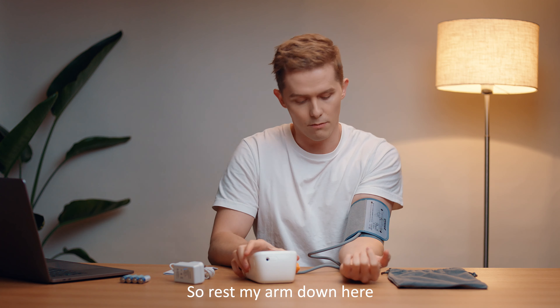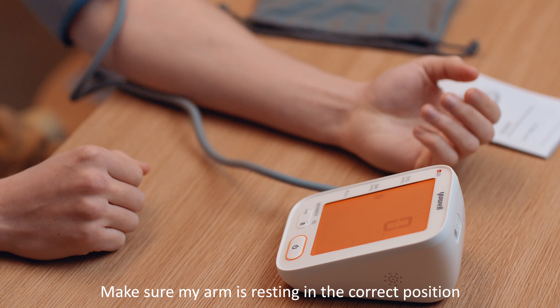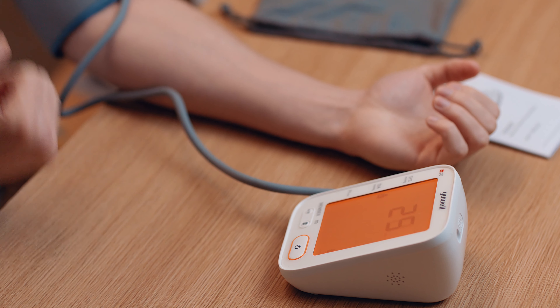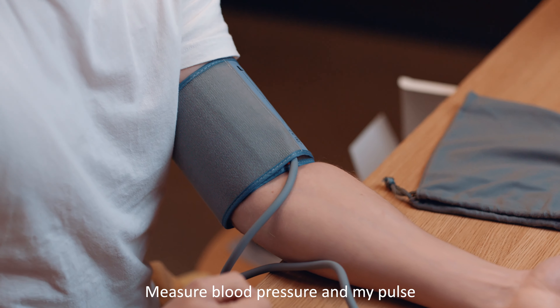Simply turn it on using the power button. Rest your arm down and turn it on ready for measuring. Make sure your arm is resting in the correct position and it'll start to inflate — the cuff will inflate and begin to measure your blood pressure and pulse.